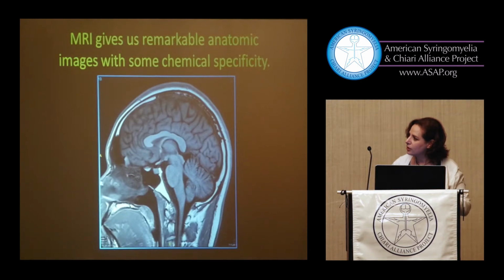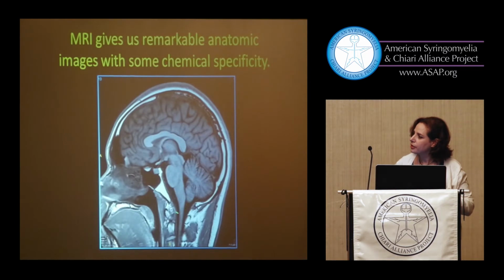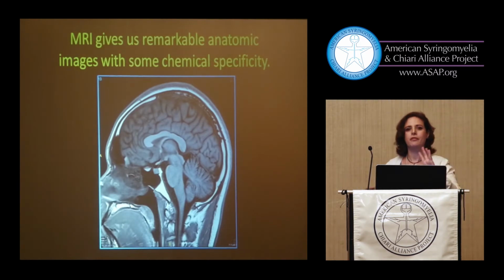Brain stem, spinal cord is down here. This is one of the cerebellar tonsils. This is a normal brain. In a Chiari malformation, this little tonsil here is pushed down into this black space, which should be just fluid. That's really it. And that has to do with the structure of the posterior fossa, the structure of this part of the skull. And that's what we're all here about, believe it or not. But that has implications for a lot of processes, and that's what we're going to talk about next.